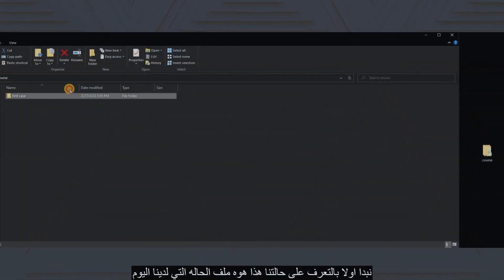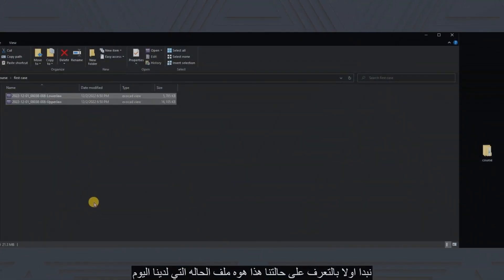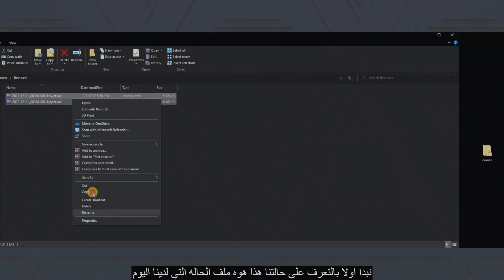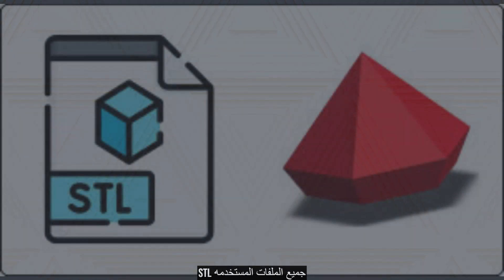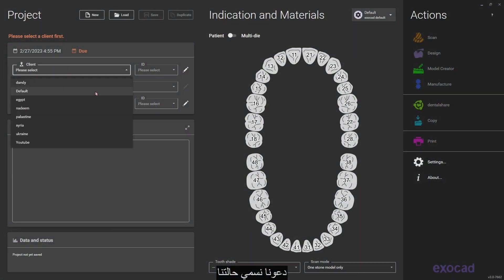Let's start first by getting to know our case. This is the case file that we have today. All our files are formatted as STL files. Let's name our case.